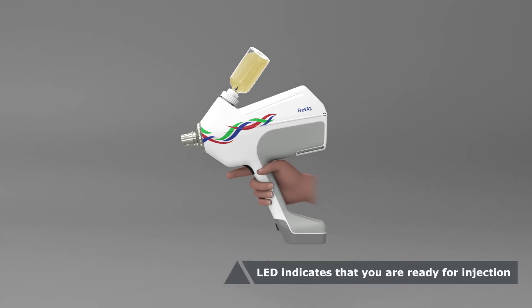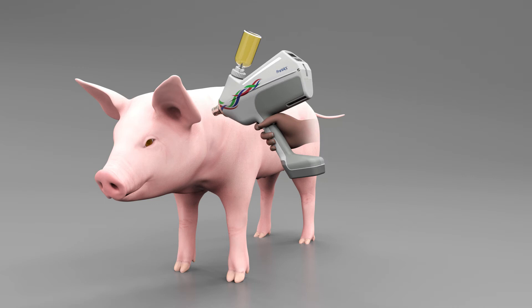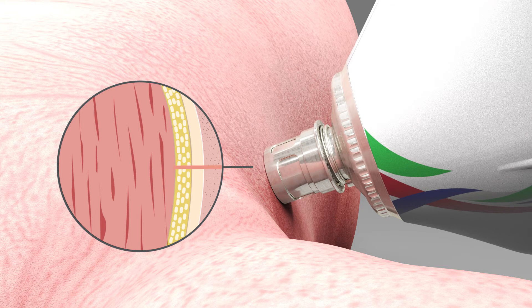After priming, readiness for the first administration is indicated by flashing white LEDs. To administer, press and hold the trigger on the handle of the device and apply the injection head to the skin of the piglet at a 90 degree angle. An integrated sensor automatically triggers the injection as soon as sufficient pressure is applied.